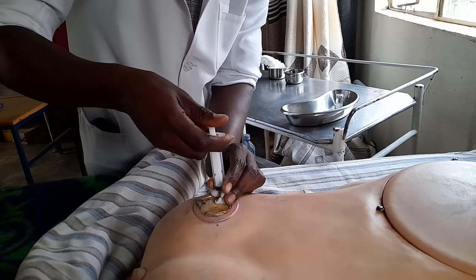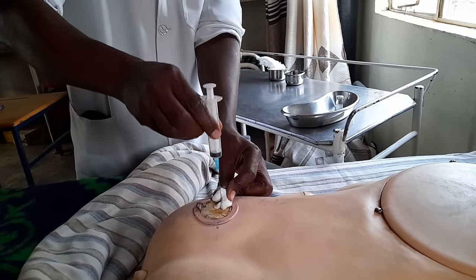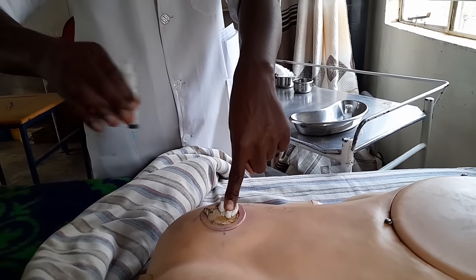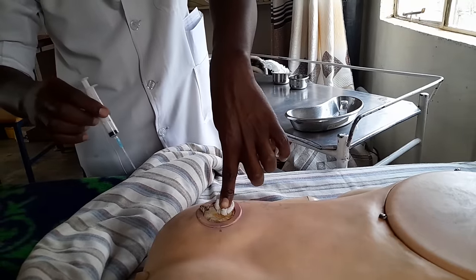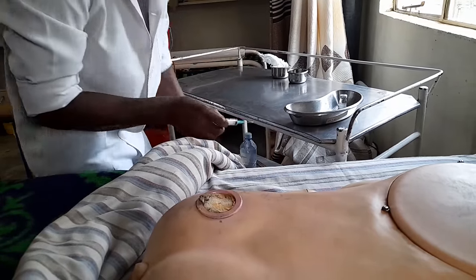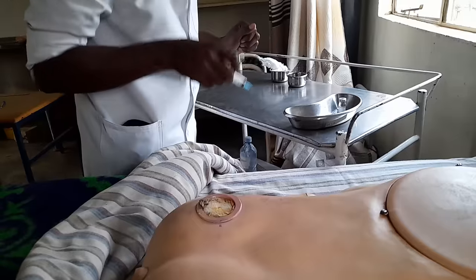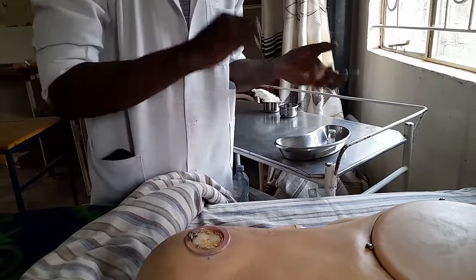After giving the injection, hold and remove the needle. Press the site with the dry swab — do not rub, just press. Once bleeding has stopped, remove the swab and throw the needle and syringe straight into the sharps container. No recapping.